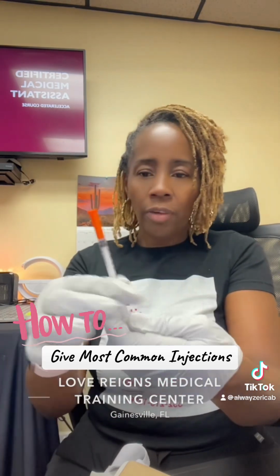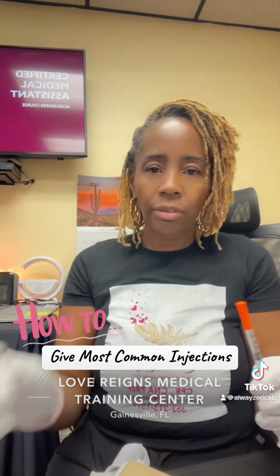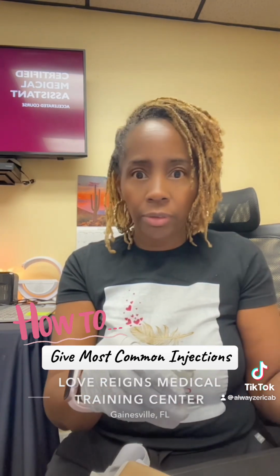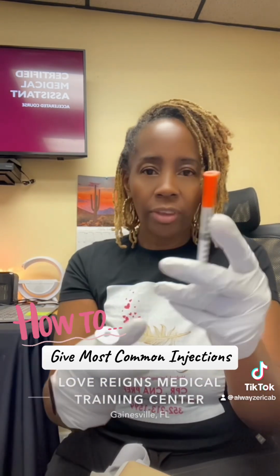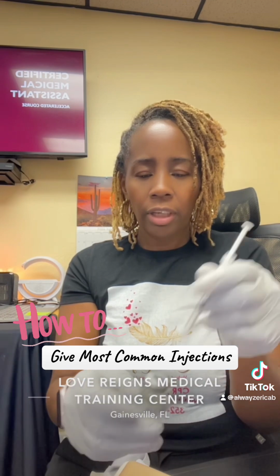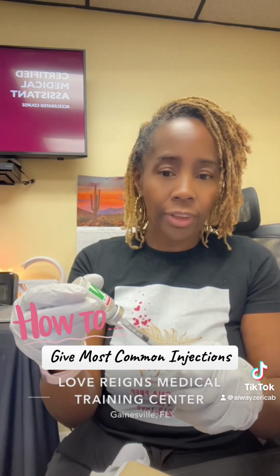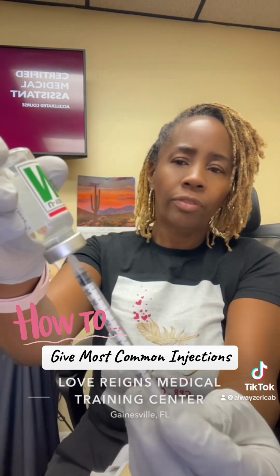Insulin, whatever the doctor would have said in the order, say they gave the orders for 40 units of insulin. You would clean your stopper, and you will let that air dry as well. And then we're going to push back. So if I need to pull up 40 units, I'm going to pull back the air for 40 units, and then I'm going to push that air into here, like this. We would have already verified that this is the right dose, the right amount, the right order, the right everything, right? Now I'm pushing in the air, and then I'm going to pull back to the 40 units, okay?